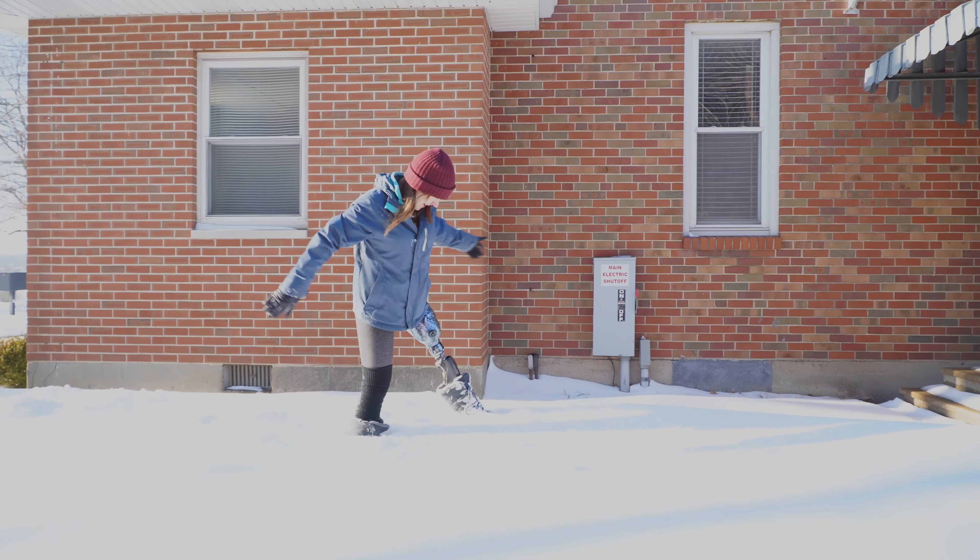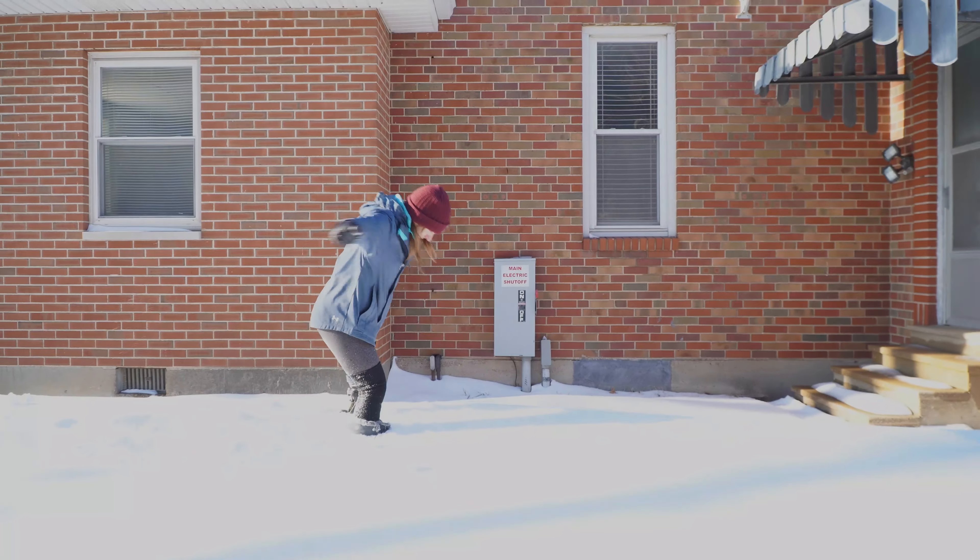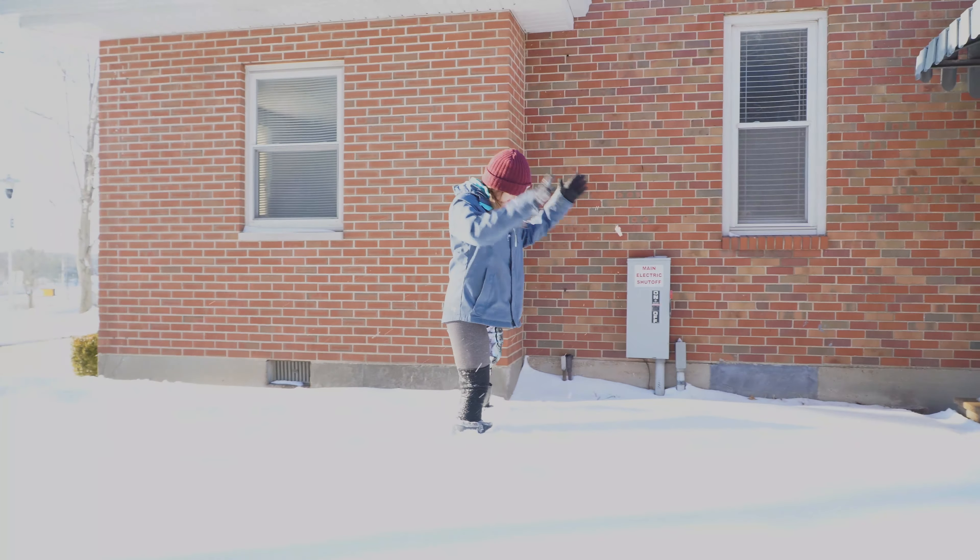Hey, this is Christina the Amputee OT, and in this video I'm going to show you how I get around in the snow with my above-knee prosthesis.